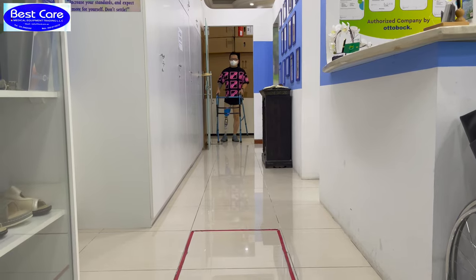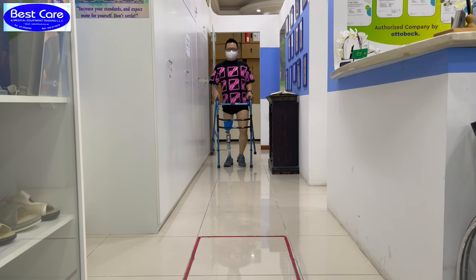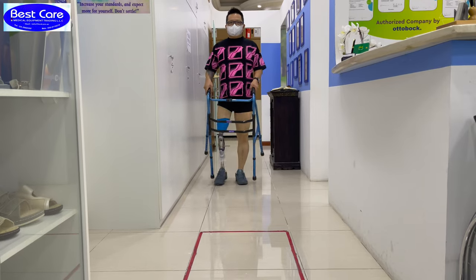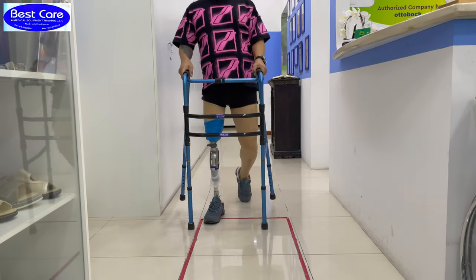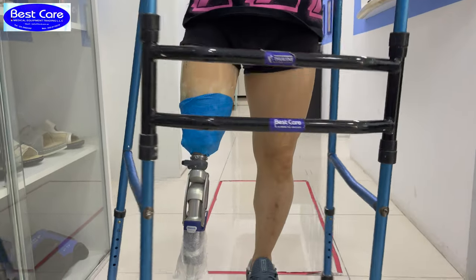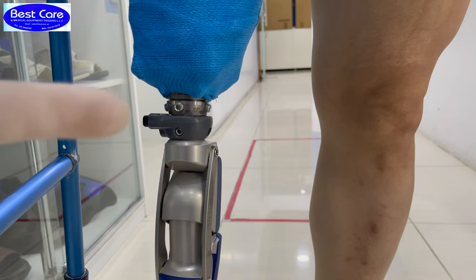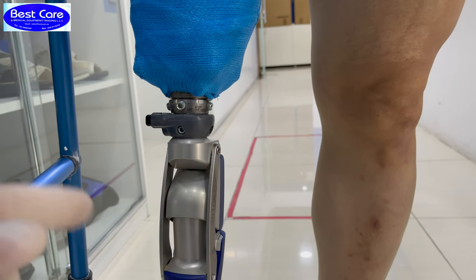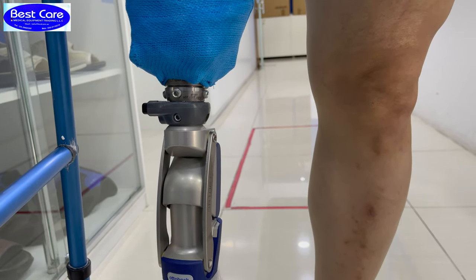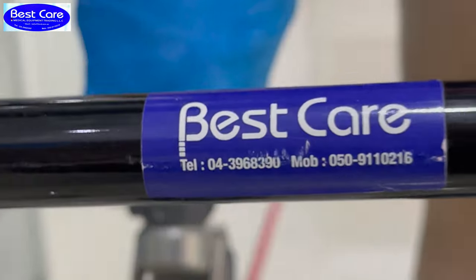Between the knee and the socket, I have the rotation adapter, and you can see that it's making it very easy for him that later, when he is alone and wants to just activate this one and rotate the foot, he can wear the shoes by himself very easily. Thank you very much. Just continue.